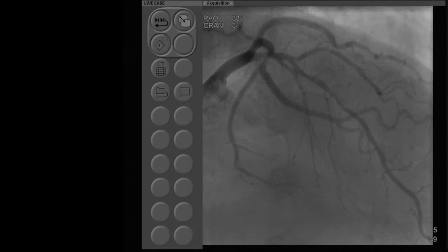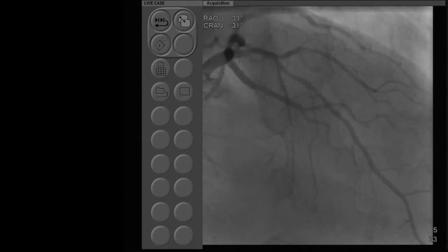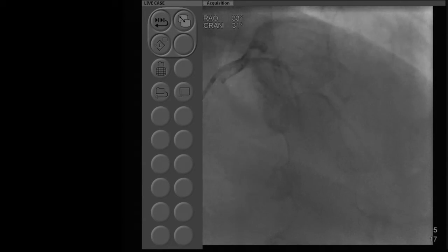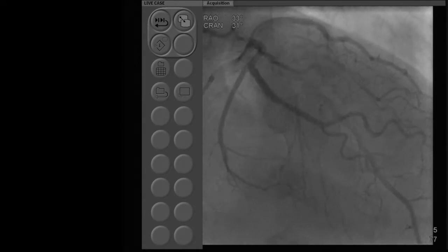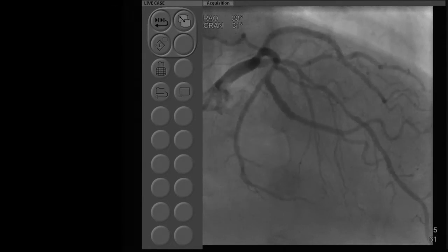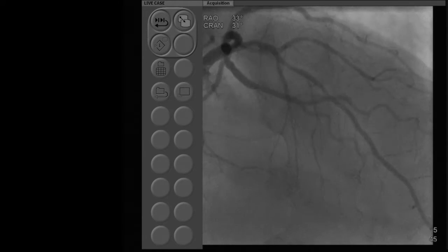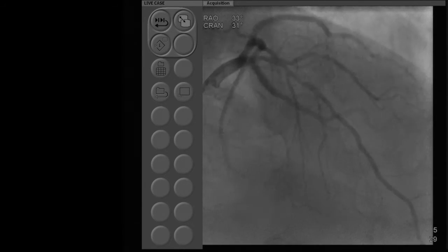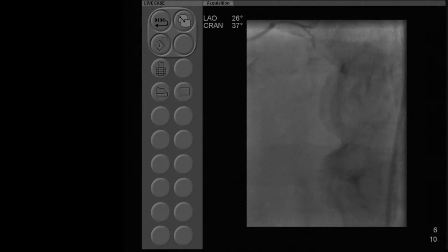With a stress test showing intermediate findings, although the apical was mild, and it was more inferolateral because of the circumflex which looks very good now — clearly it's always a challenge. You bring the case for a live case, say FFR, and it's non-significant. What are you going to do? I wish there was a way to poll viewers on how much the FFR would be — both the LAD and the diagonal. The key is the diagonal as the ostial lesion, and then there is another lesion a few millimeters below.